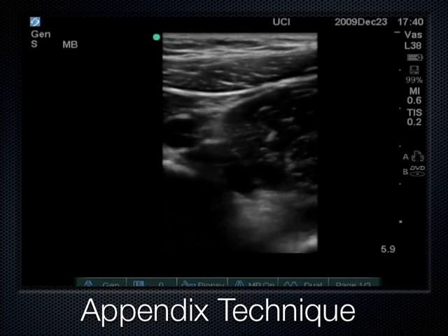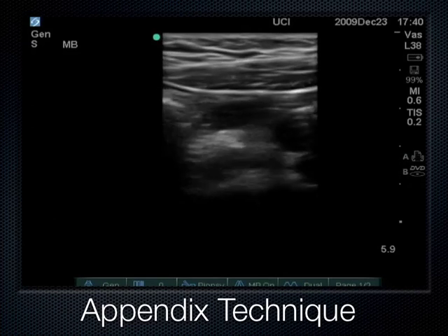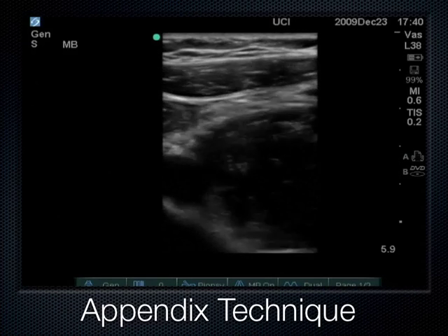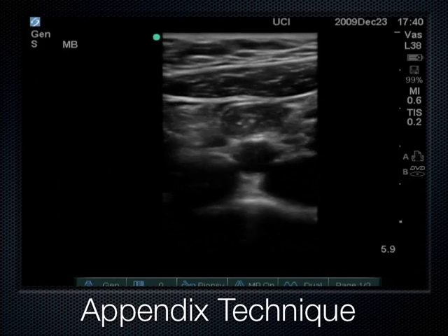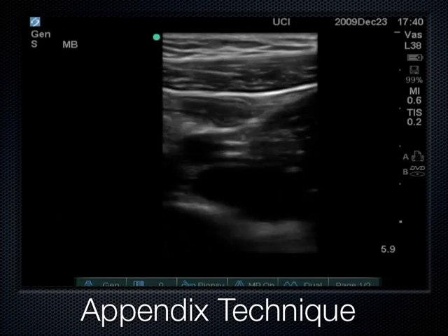So this is kind of what we do. Here's the abdominal wall musculature up here. Here's a loop of bowel right there, okay? This is iliac vessel right there. And what we're doing is we're pushing really hard. So this muscle right here, this is the psoas muscle. The psoas muscle is actually coming up and coming into contact with the abdominal wall musculature right there.